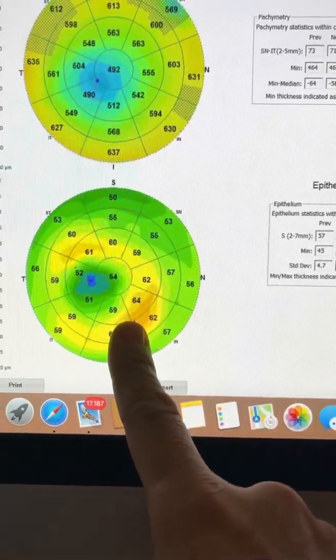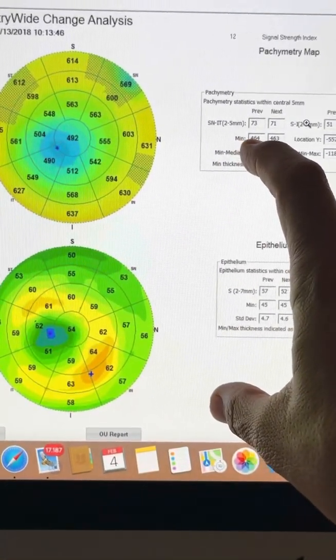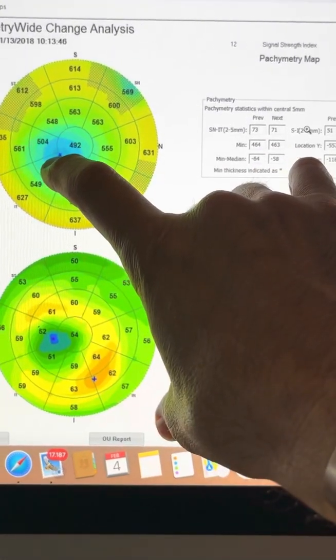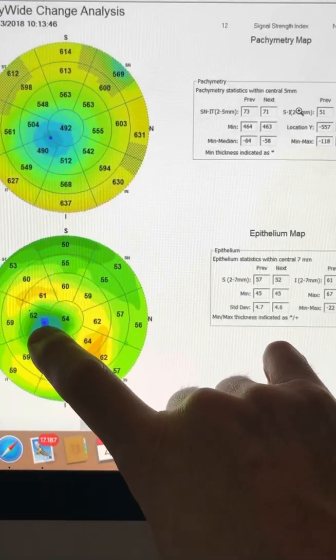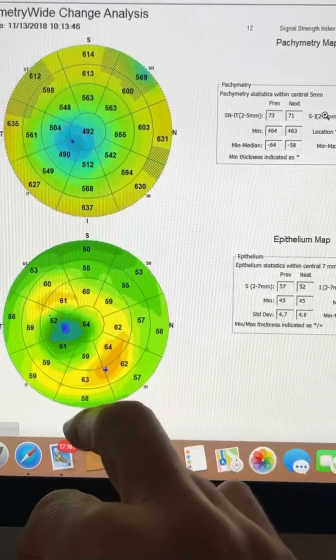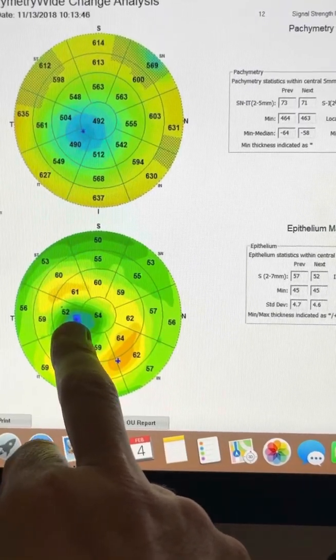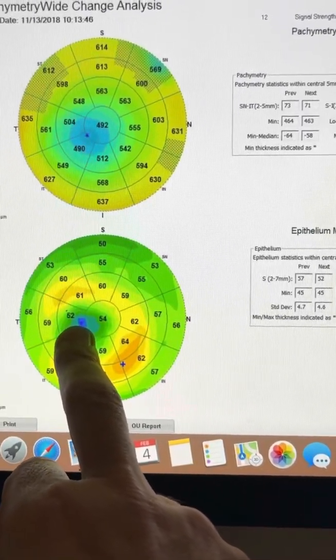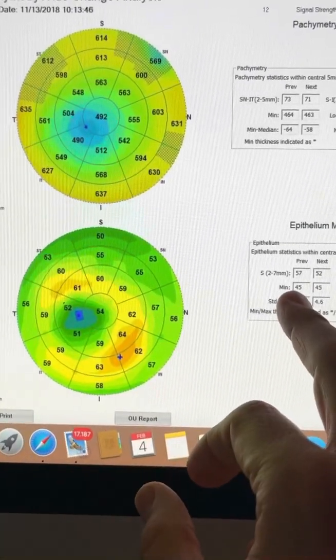We have her measurements here from 2018. And her minimal thickness is 464 microns, obviously at the thinnest part of the cornea, which is the peak of the cone as well. And we can also see how, at that time, the epithelium over that area was the thinnest. The thinnest epithelium that she measured back then was 45 microns. Actually, the blue color here, she's probably between 35 and 40 microns.